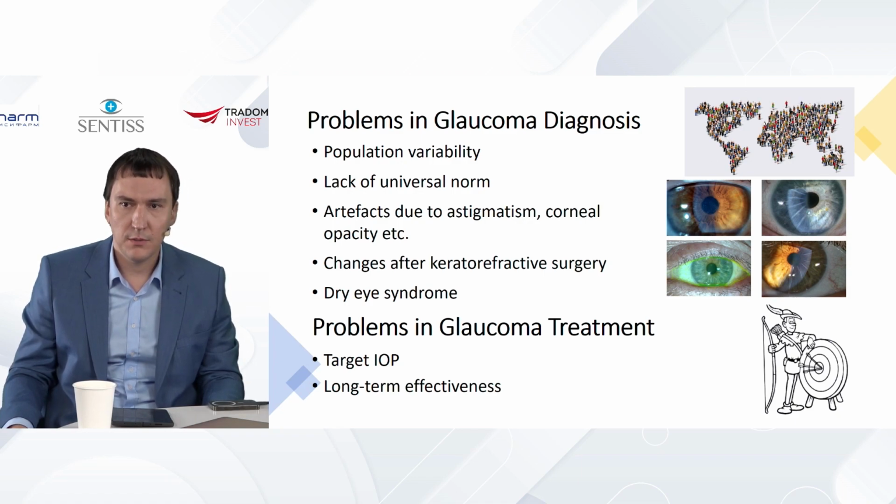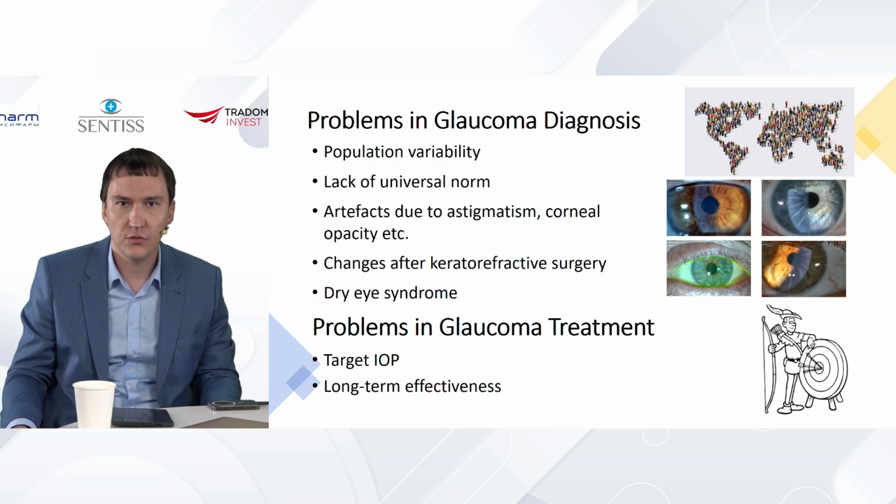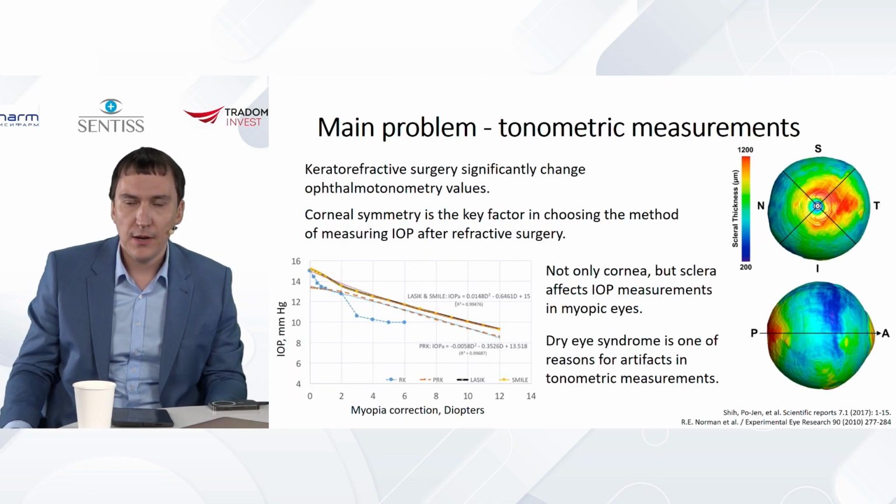Looking at the level of intraocular pressure and comparing with the norm, we can suggest this or that scenario. And in the scenario, the decision is made about the treatment or just monitoring of the patient, and I think that's the most important. So that means prognosis and decision making. So that's what we have to pay attention to in the development of AI in glaucoma.